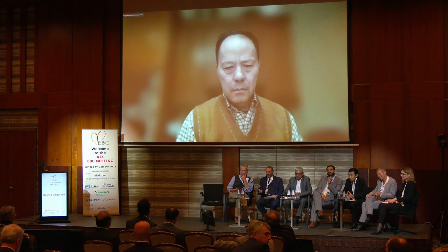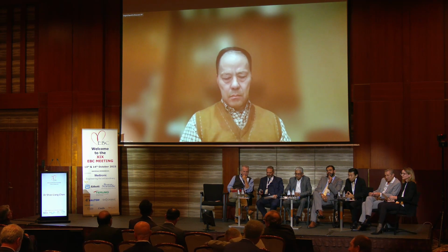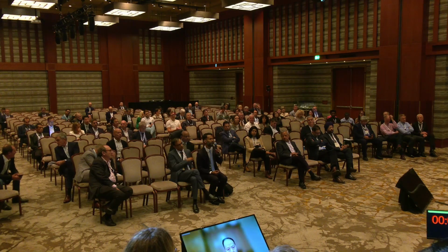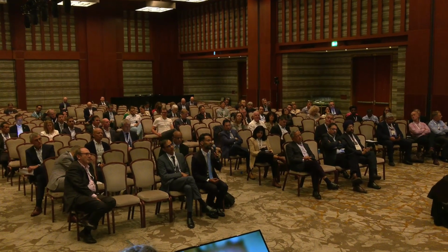Thank you. Any last one? Kushan, just wanted to ask a question, because in this we are only treating the side branch after we've already implanted a main branch stent. So do you think that calcified lesions can be enrolled in this trial, because we don't have an option of using a cutting balloon or rotablator if it is a calcified ostium of the side branch, even if it is a short lesion? Yeah, very good question.